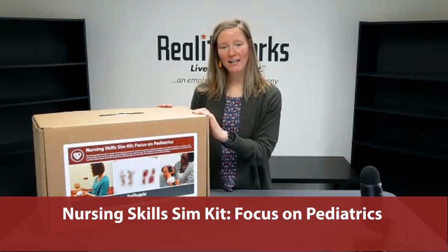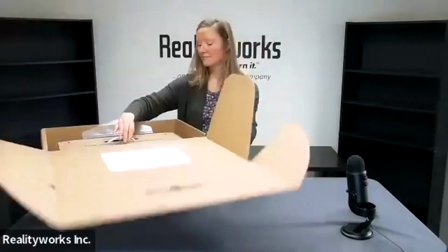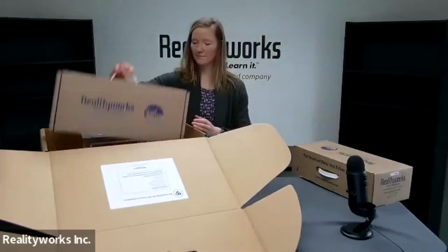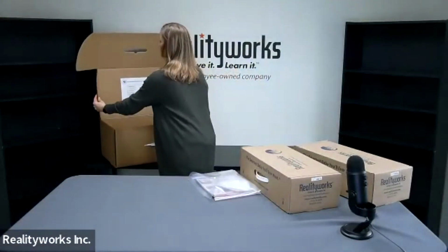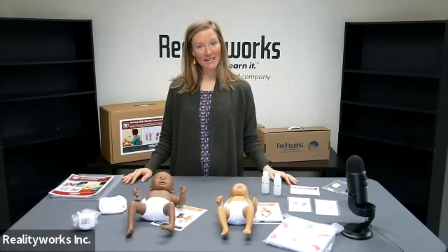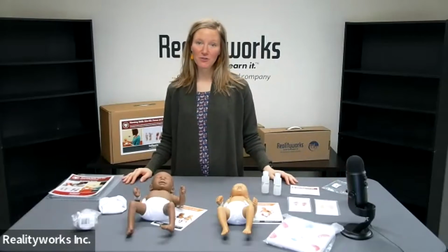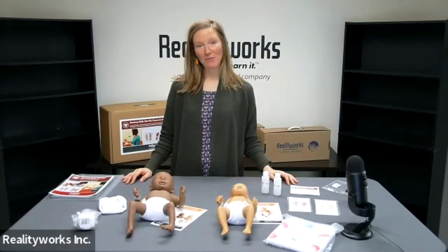Take a closer look at our Focus on Pediatric Nursing Skills Sim Kit here. It's one of 5 kits we created to help secondary, post-secondary, and nursing training course instructors save time creating standardized patient scenarios. Using the step-by-step instructions that come with this kit, you can create scenarios that let your students experience multiple points of view, that of the patient and that of the healthcare professional.